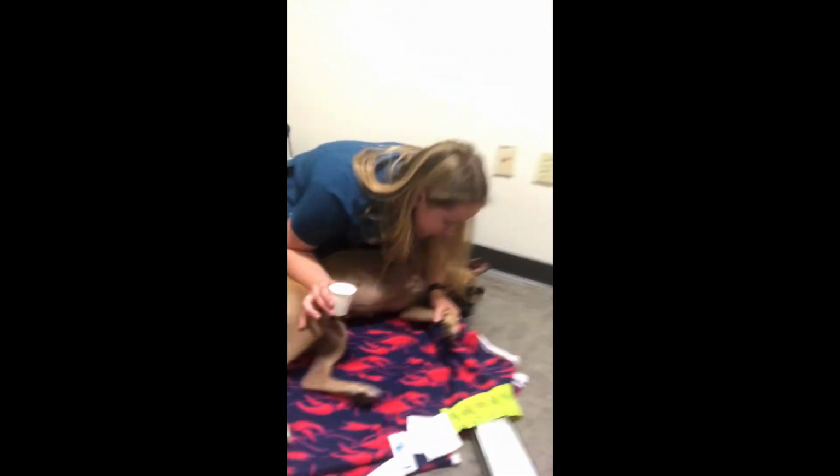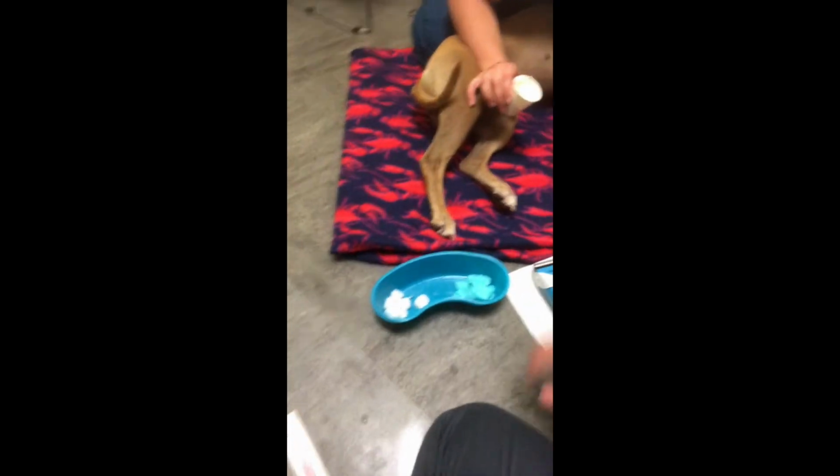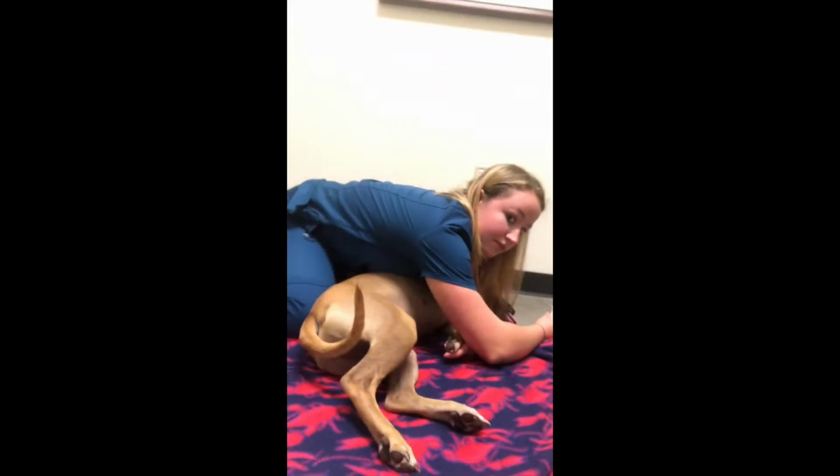So I'm going to place a saphenous catheter in this patient here. We have her in lateral recumbency. I have all of my things. I have some catheters to choose from, my clippers, my cap, some scrub and alcohol, and we will go ahead and place this.